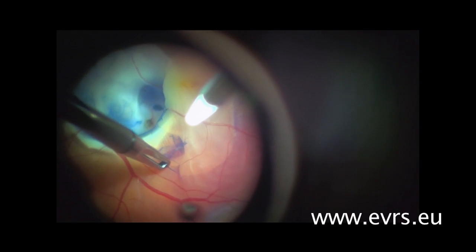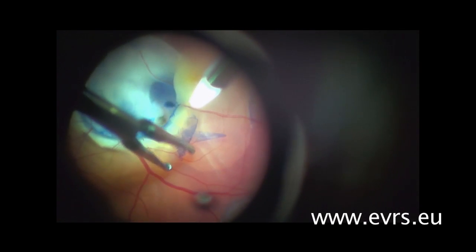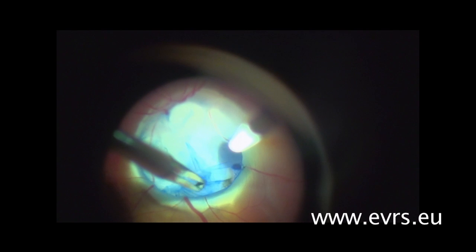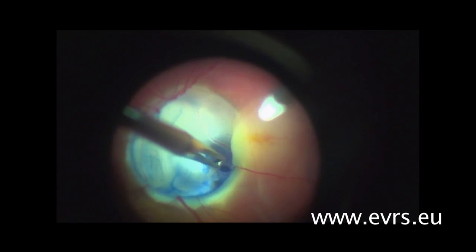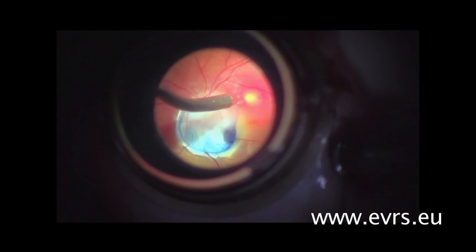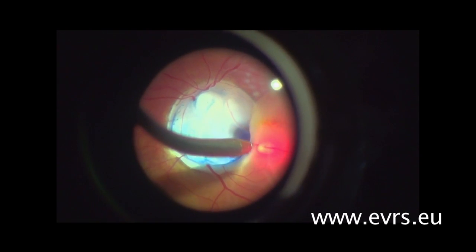In this specific case, this is a new technique which I suggest may be used. I peeled a flap where I could peel, because in the center it was not possible as it was already peeled. And I introduced the ILM into the optic pit. We call it stuffing of the optic pit. Some laser was additionally added, but the fovea is just at the margin of the optic nerve, so it was not possible to make laser in the fovea, and air injection followed. Already 7 days after the treatment, the retina was completely reattached, with no maculopathy, and it persisted for about 6 months until now.